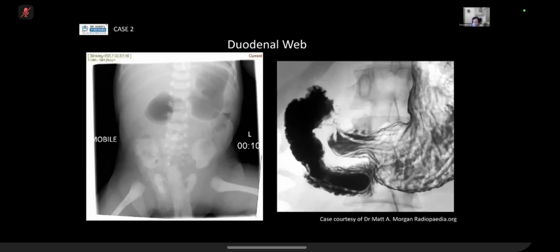Yes, sorry. So I did lie. I use Omnipaque for my upper GI studies, 350, but for my lower GI, I will use Urografin at 100 to 150. So yes, it's diluted, a form of iodinated contrast, water soluble.